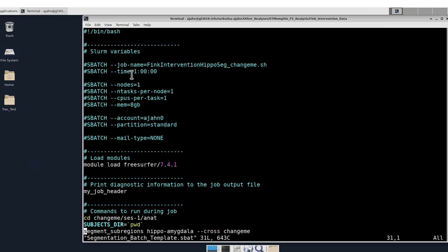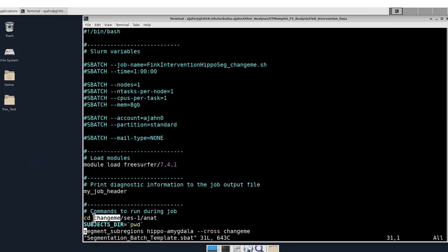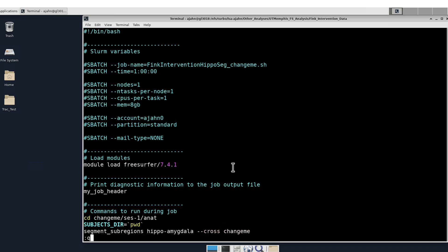I also load FreeSurfer 7.4.1, and I have a variable called changeMe that I put in my cd and segment_subregions command.